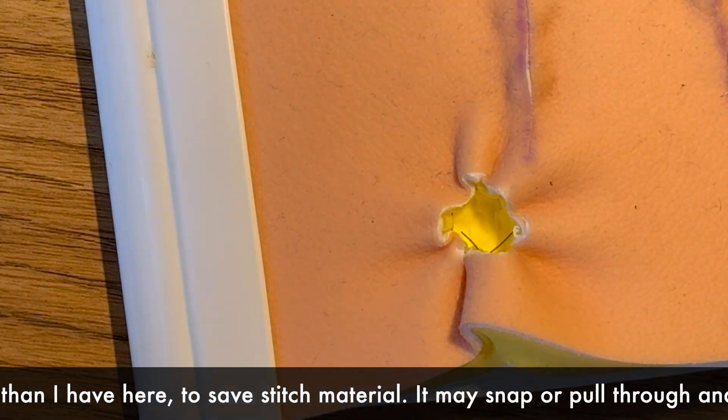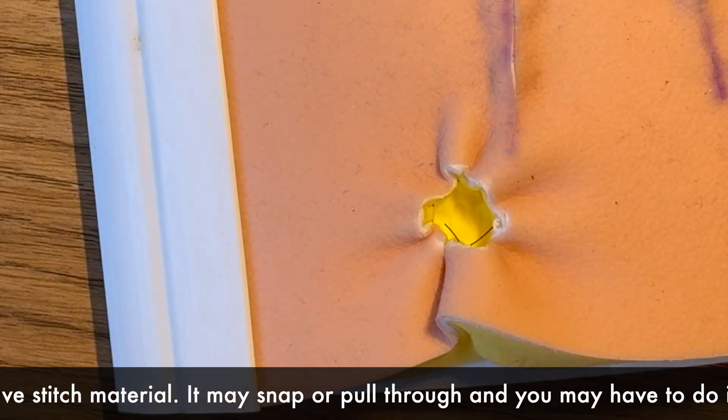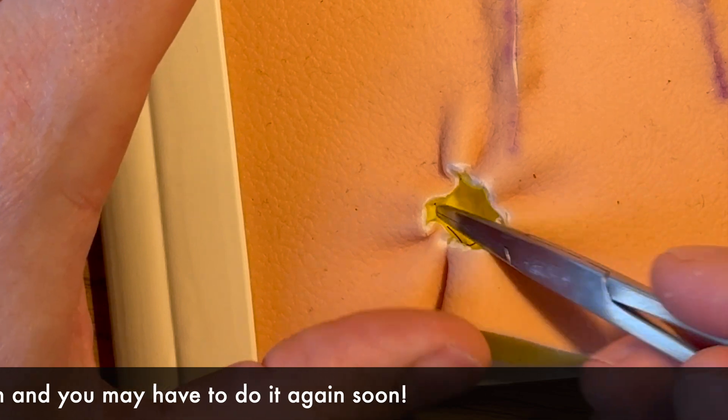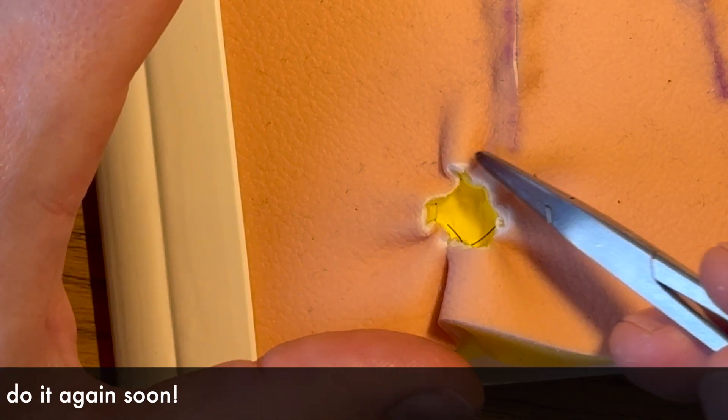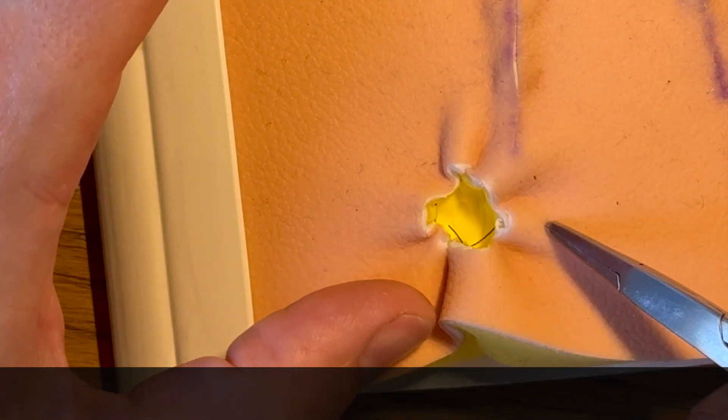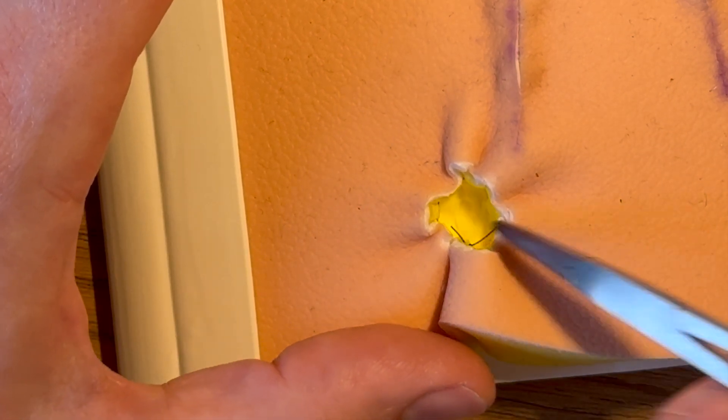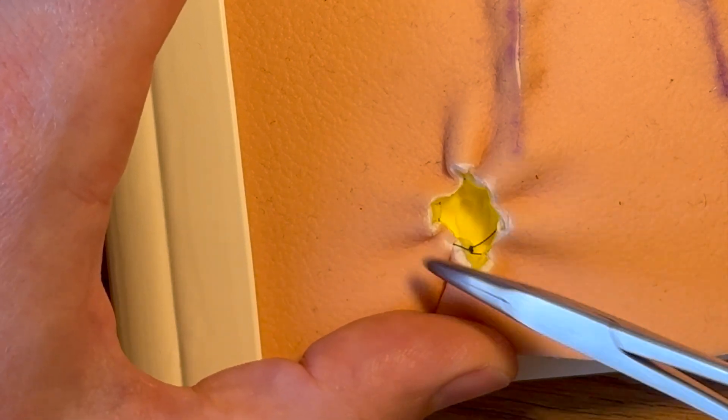And then what will happen is that will gradually heal by secondary intention and it will fill in. The edges will come together and then all these bobbly bits will sit down and it'll flatten over a period of weeks. So you tell the patient not to be alarmed, it's going to look very odd for a bit and then it will all sort itself out.